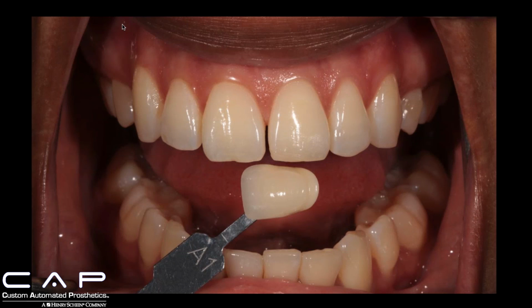Elizabeth is very close to an A1, but if you study this photo, you can pick out many things that are not an A1. Towards the cervical portion of her tooth, she's got a much higher value than the cervical portion of the shade tab. She's got light hypocalcification, which a lot of people do. She's got very subtle effects and striations going through her tooth, but an A1 was a good starting point.